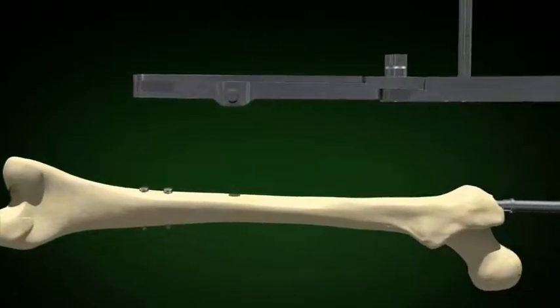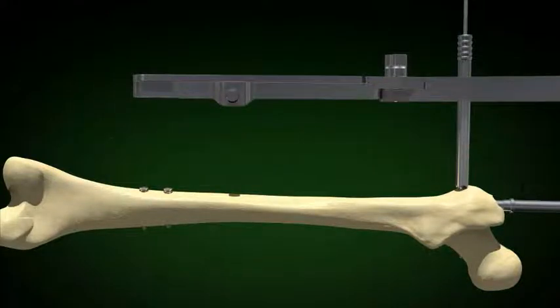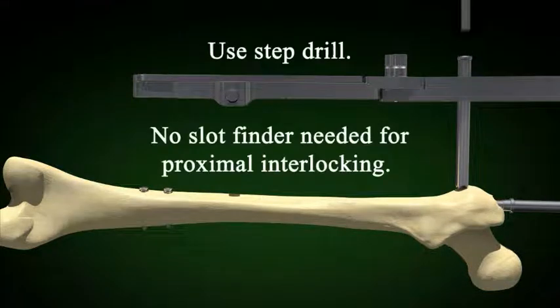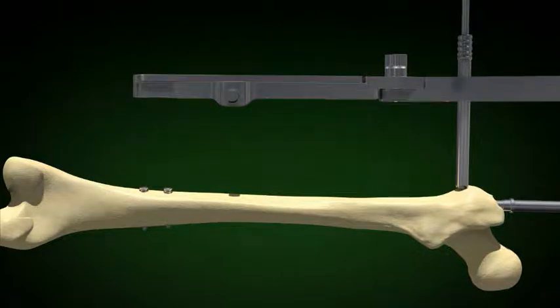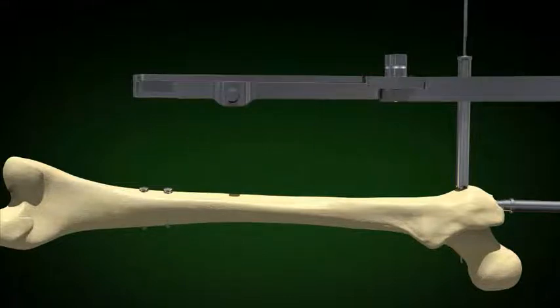The proximal interlocking screw is accomplished by drilling through both cortices at once. The step drill is used to enlarge the hole. The slot finders are not needed for the proximal interlock. The depth gauge is used to measure the length of the screw. Add 5 millimeters so the screw will extend 2 threads on the far cortex and 2 threads on the near cortex.